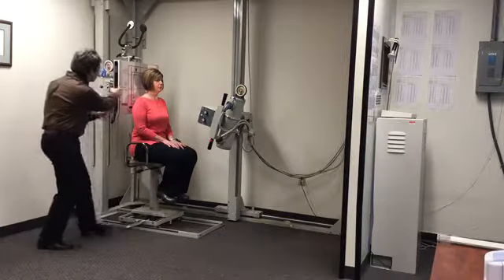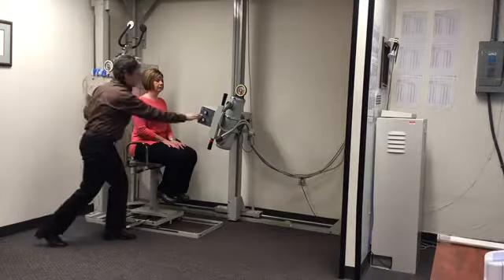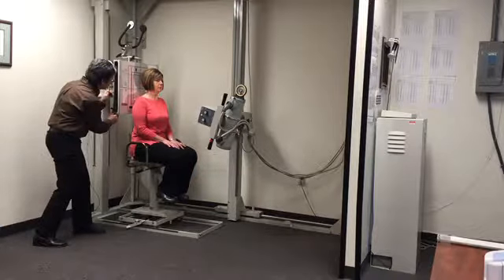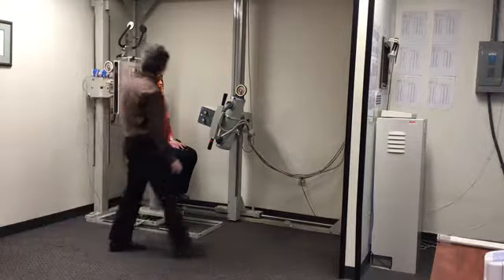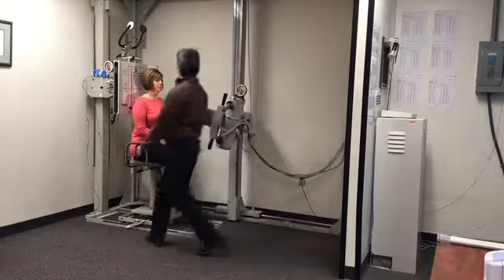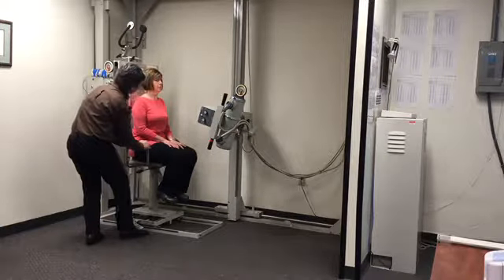Okay. If we need to, we could fine-tune our bucky up or down a little bit so that that horizontal pinstripe of the bucky superimposes the horizontal crosshair of the tube. So I'm going to just drop this bucky just a tiny little bit, superimpose my beam. All right, so bucky to patient, patient to bucky, tube to bucky and patient. I'm going to check her and make sure that she is centered to the vertical crosshair right through the center of her neck. This is the mid-sagittal plane of her neck.